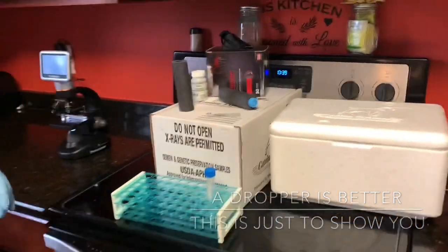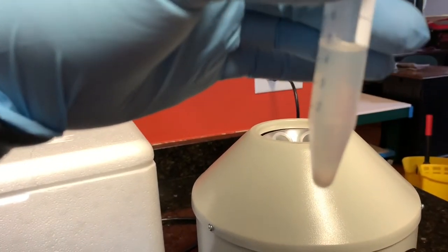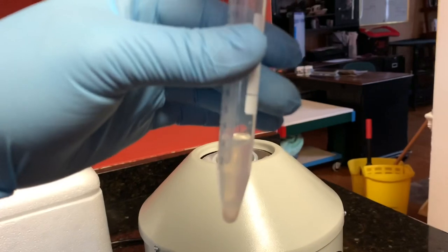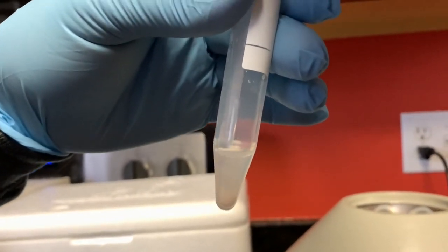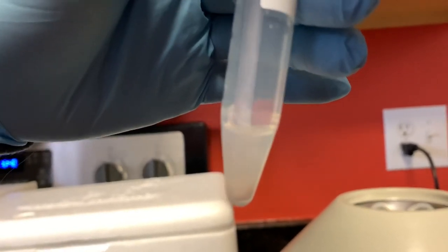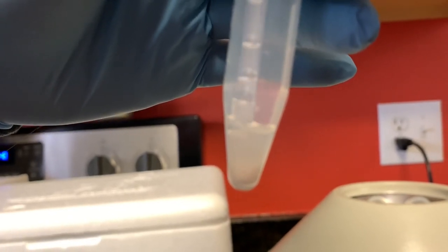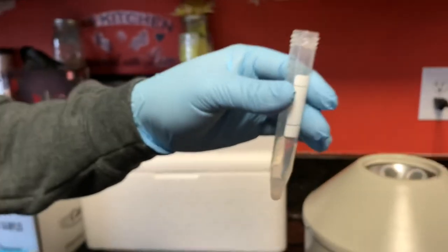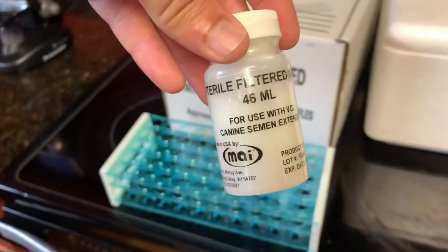We're gonna do the same thing with the next one. So Justin's gonna go back in there and remove more of that. Is that all you can get? All right, we're gonna leave it like that. You wanna get more than that, but we're not actually gonna use this semen, so it doesn't really matter. Right here we have the extender.